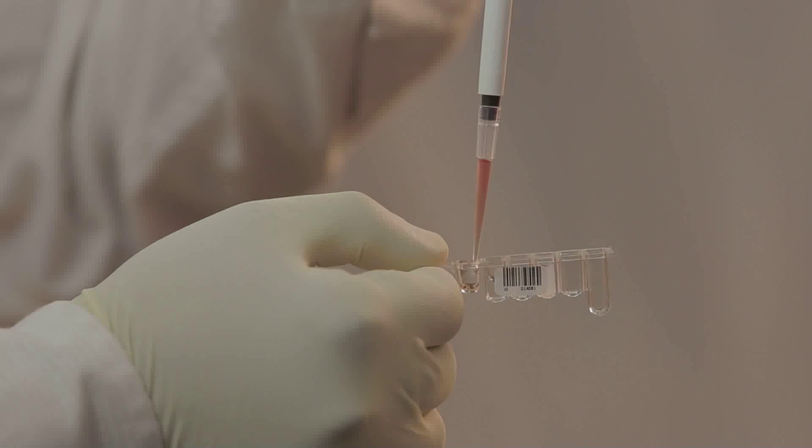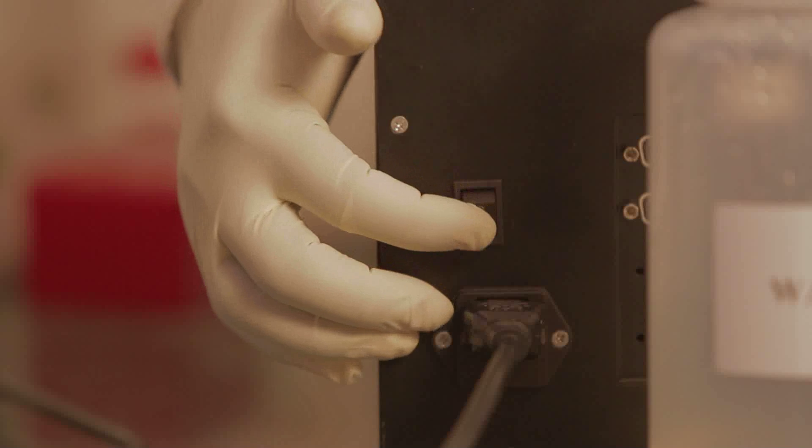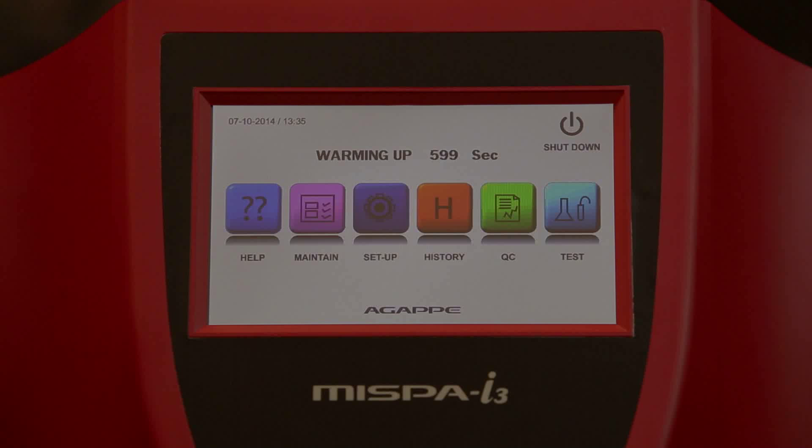The sample is loaded on a specially designed cartridge that uses only a few microlitres of sample. Switch on the analyzer. The analyzer will enter into self-test operations along with temperature stabilization that will ensure the analyzer is properly working.